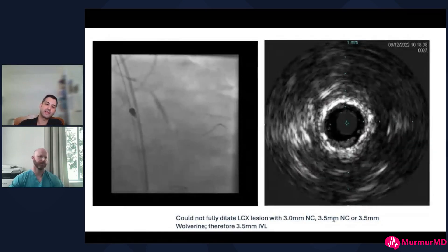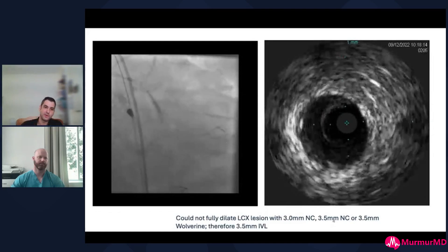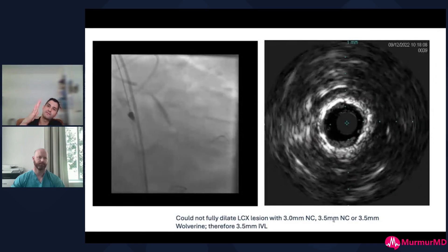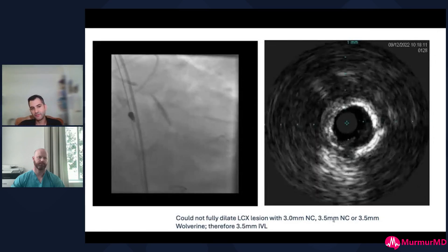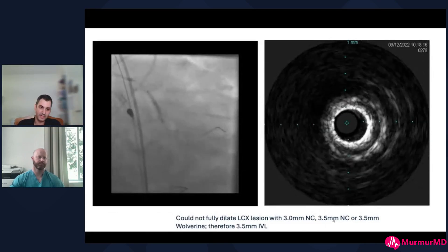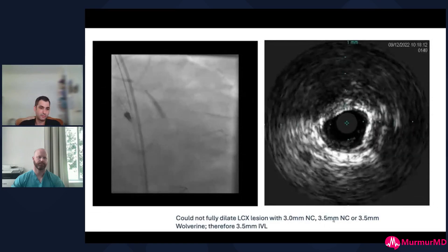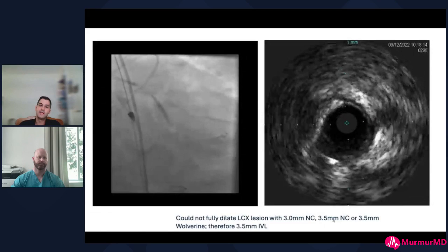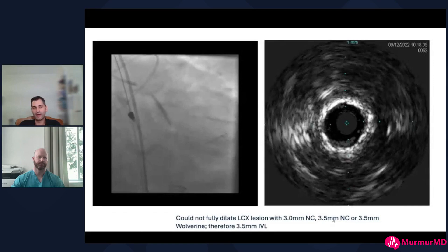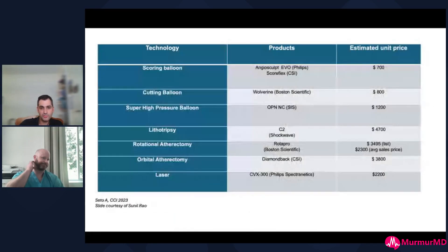The worry with a shorter balloon is that when you pull back you can have areas of geographic miss and think you've dilated everything when you haven't. With a 30mm non-compliant balloon, you also get information on deliverability — if you can get a 30mm NC balloon down, you're probably going to be able to get lithotripsy and a stent down. And you can clearly see the waist where you haven't adequately modified that area.